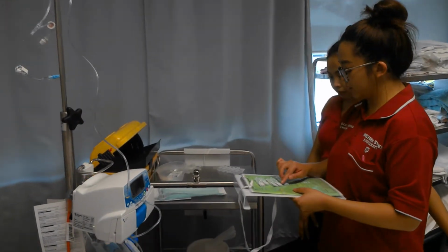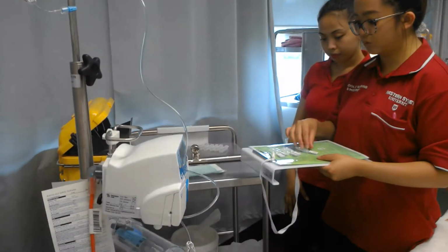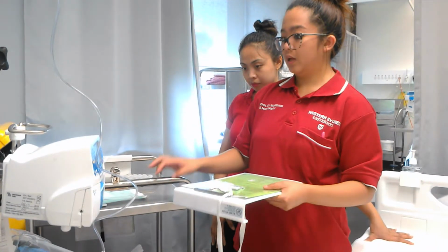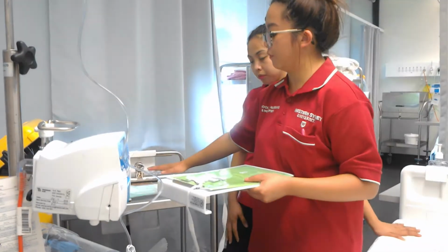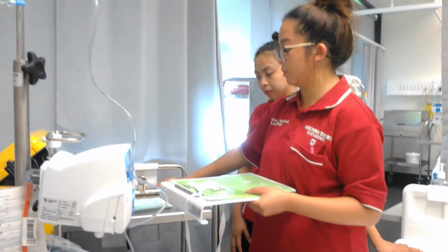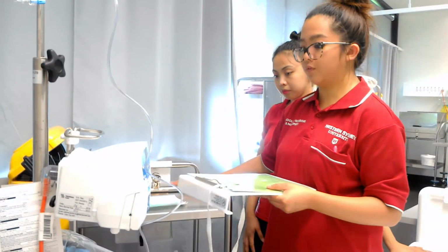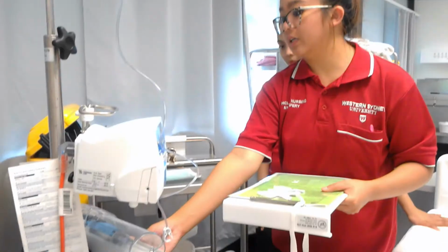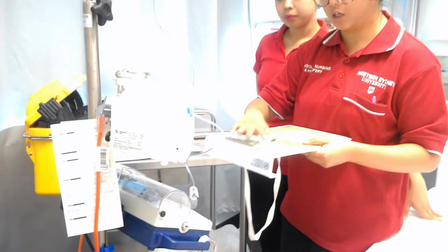So morphine, 10 milligrams in 1 mil each, so there's 5 vials, which makes about 5 mils. And this has already been included in the actual syringe with the 45 mils to make up the total 50 mils of medication. So it's 45 mils of normal saline that I added, and I've already done the criteria as well on the PCA machine.